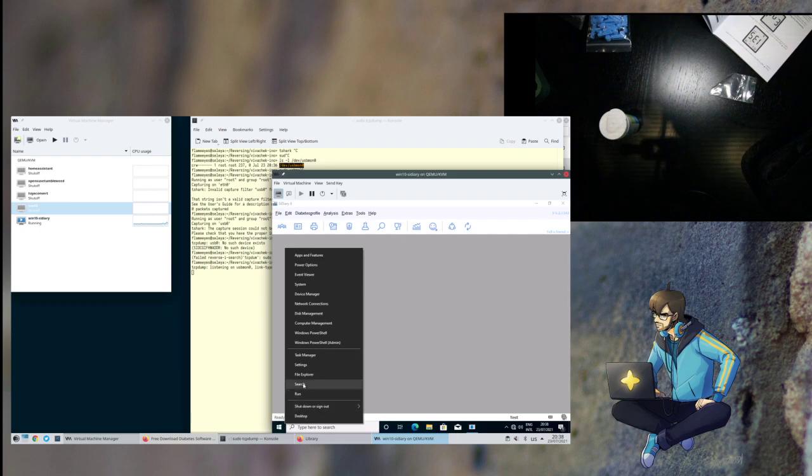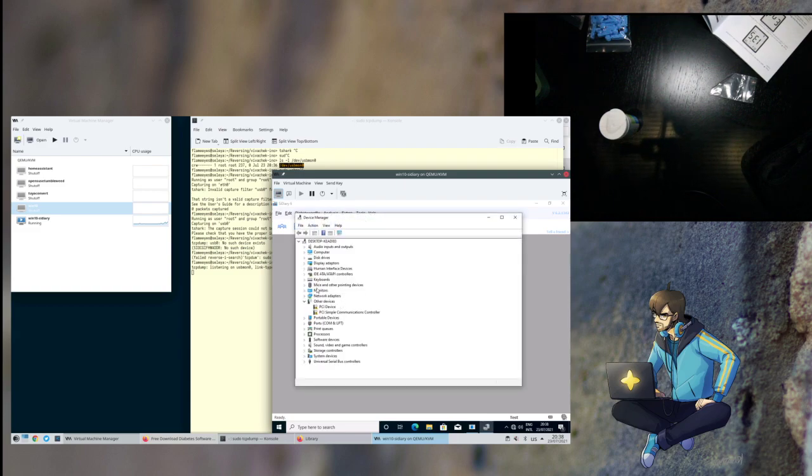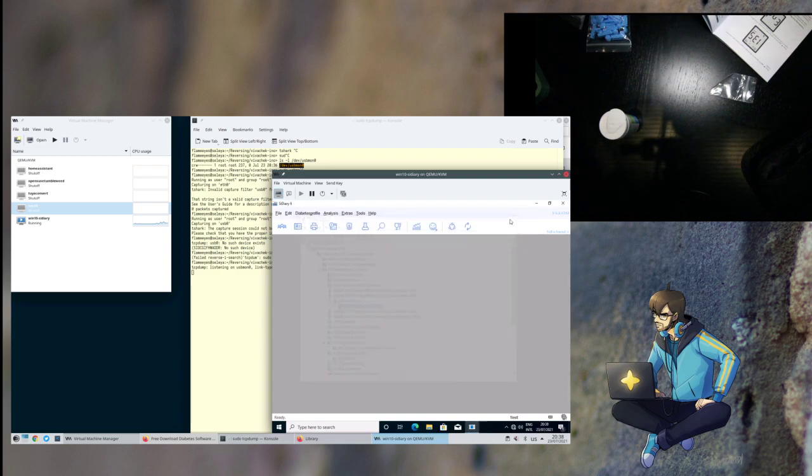So we should now be getting, let's see, device manager, USB serial device. Here you go, COM3. And if I view by connection, this is going to go, yeah, through the USB. Okay.